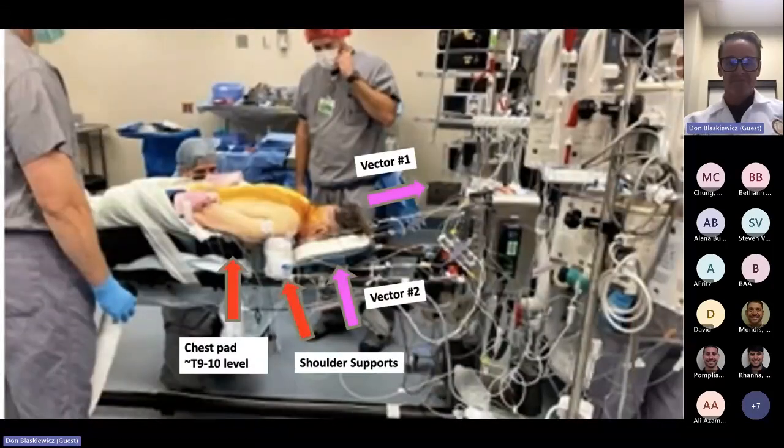Where do we go here? So this was stage 2. I think the key things for this were placing the chest pad at T9-10 and putting her in bivector traction. She had one vector, angling up this way, which was put to weights. For the second vector, I used the face pillow, and then I used rolled towels as shoulder supports to help lift that portion of the chest wall.